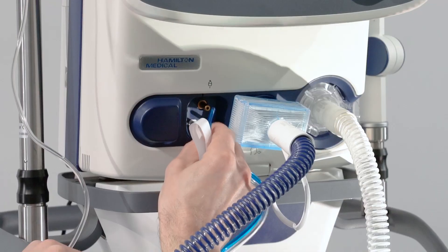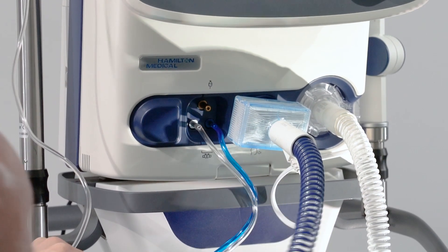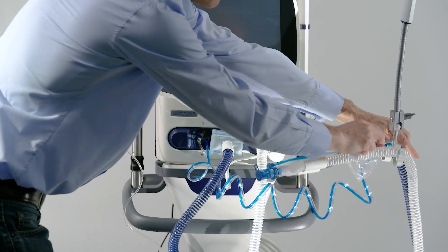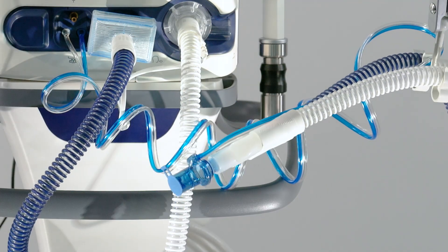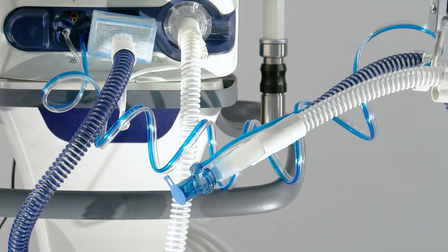Attach the blue and clear tubes to the flow sensor connection ports on the ventilator. To prevent water accumulating in the flow sensor and tubing, position the flow sensor tubing on top of the flow sensor. The gas temperature is measured at the Y piece by means of the temperature probe integrated in the inspiratory limb. Keep the inspiratory limb positioned correctly.